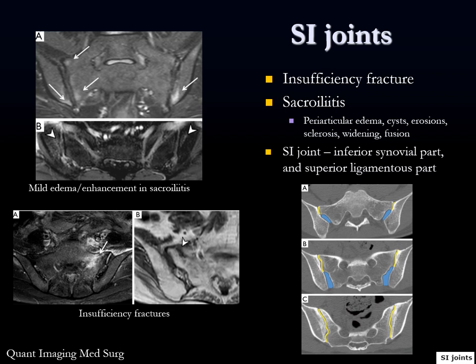The sacroiliac joints can show insufficiency fractures or sacroiliitis - abnormal edema and enhancement about the sacroiliac joints, which you'll see especially on pelvis pain protocol MRIs. Also look for linear low-signal abnormalities consistent with insufficiency fractures in the sacrum. Worth remembering: the SI joint has variant anatomy with an inferior synovial part and a superior ligamentous part, which is not synovial.